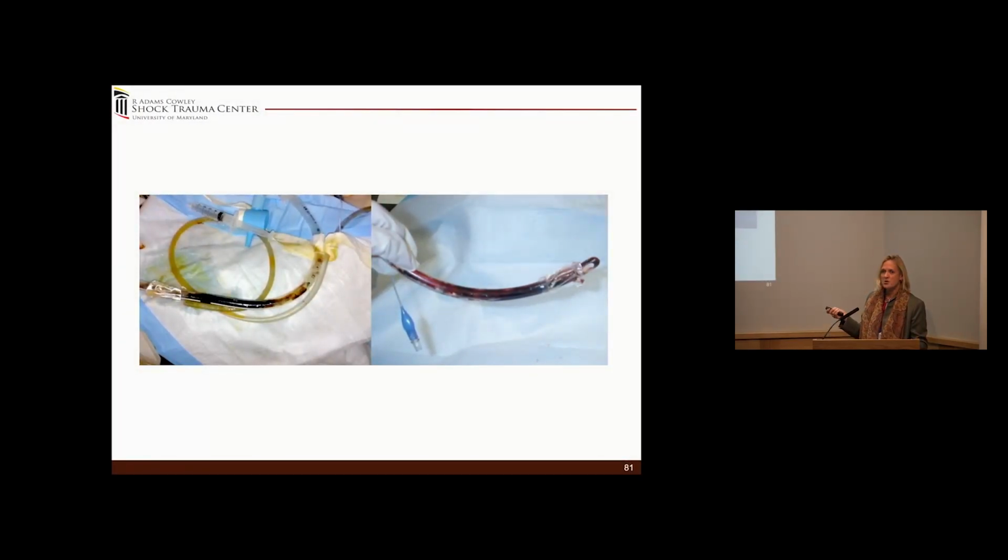So pulmonary contusion started breaking up, and this endotracheal tube became full of bloody secretions, and the interesting part was it created a one-way valve. It was thick bloody secretions, so you could pass the suction catheter in, right? But when you came back out, it actually collapsed. And so gas is going in, gas is not coming out. So this is where you would stack. It was actually interesting because you could tell from that waveform, we checked everything else, that patient got re-intubated and everything was resolved.